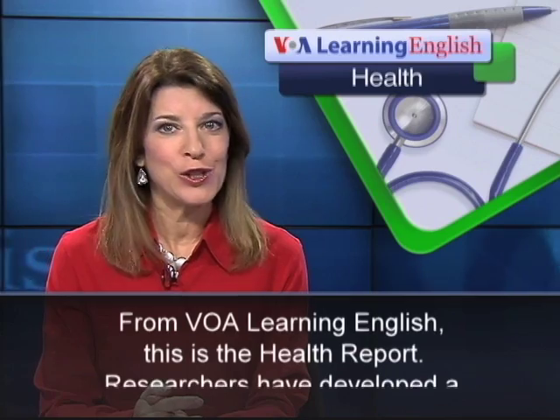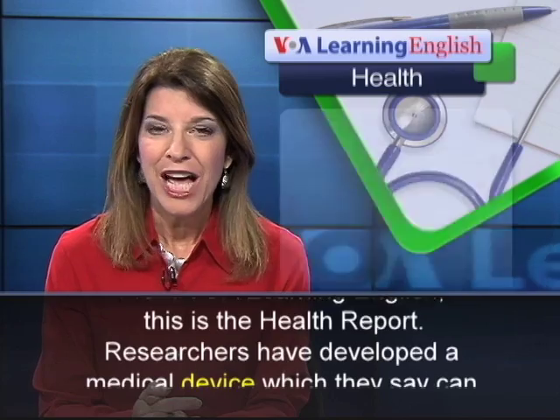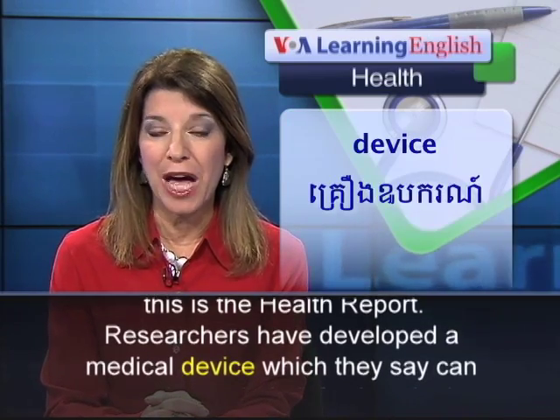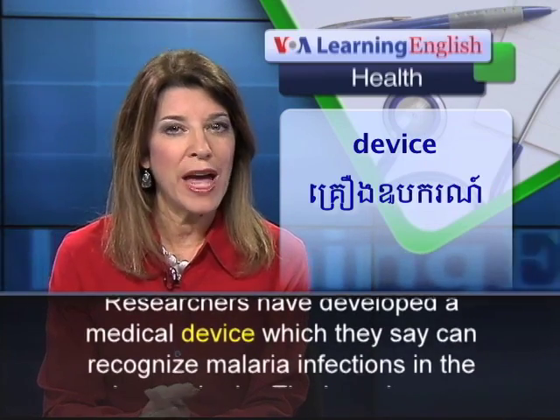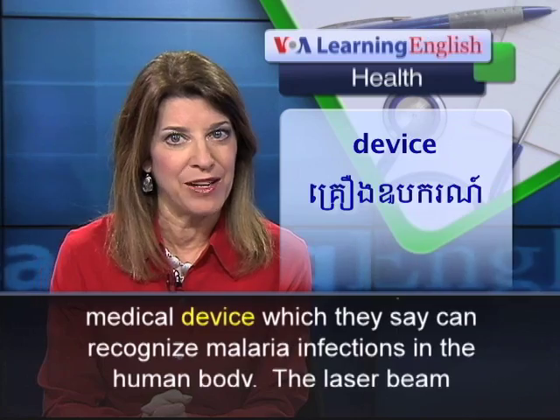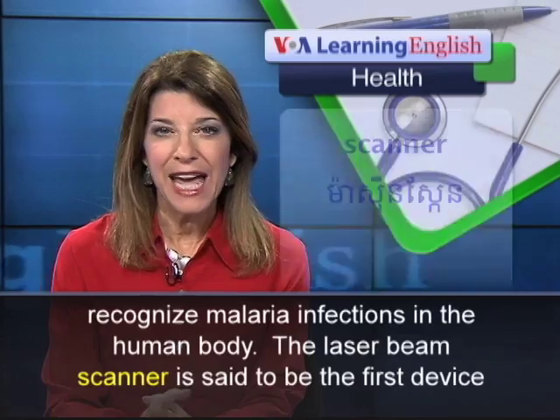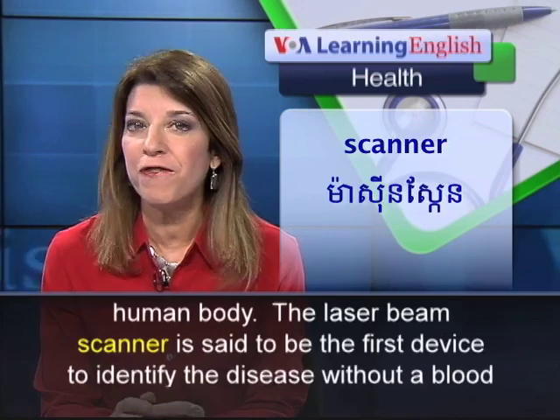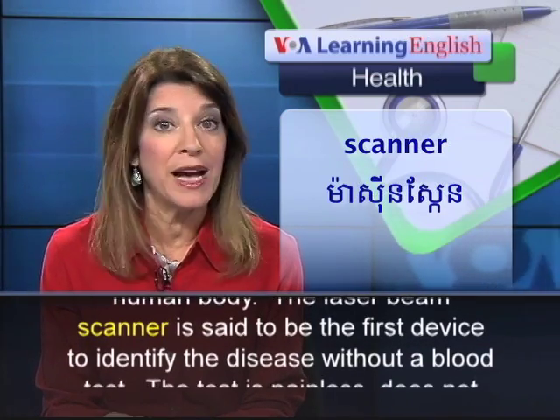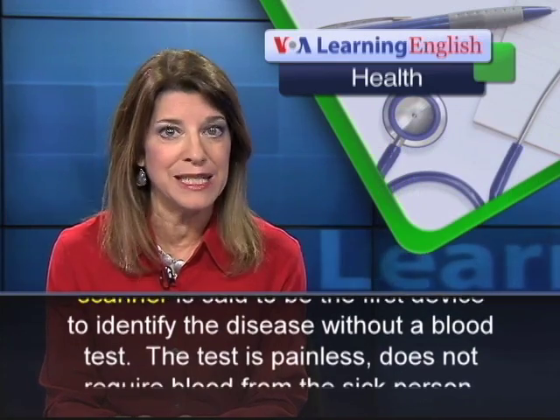From VOA Learning English, this is the Health Report. Researchers have developed a medical device which they say can recognize malaria infections in the human body. The laser beam scanner is said to be the first device to identify the disease without a blood test.